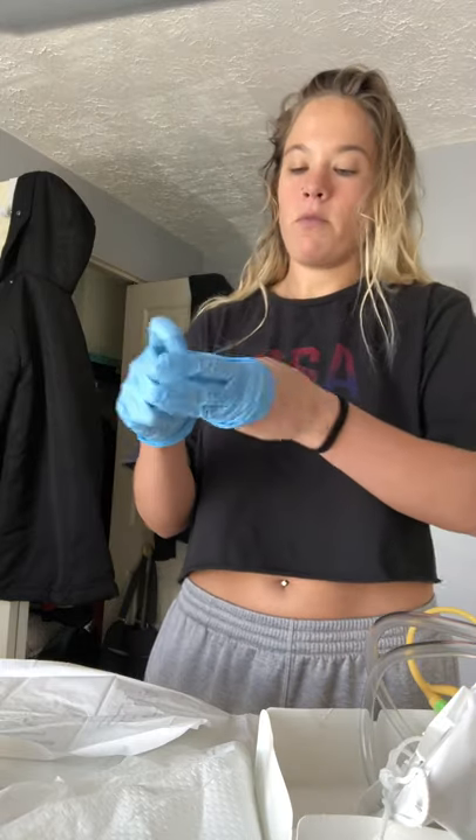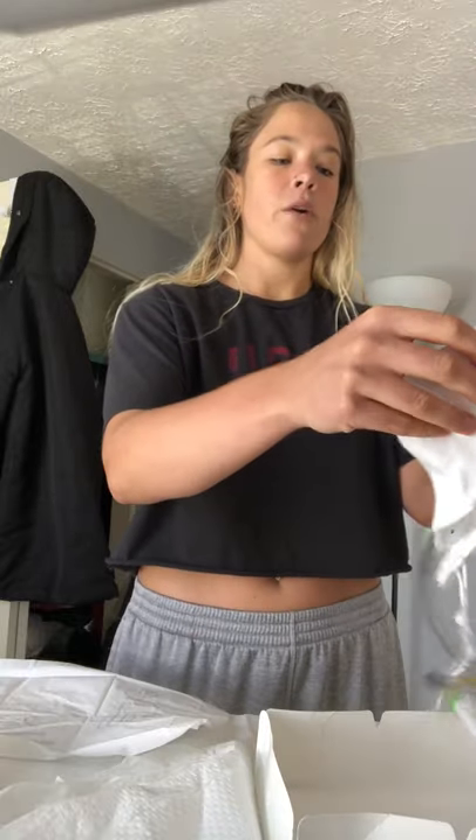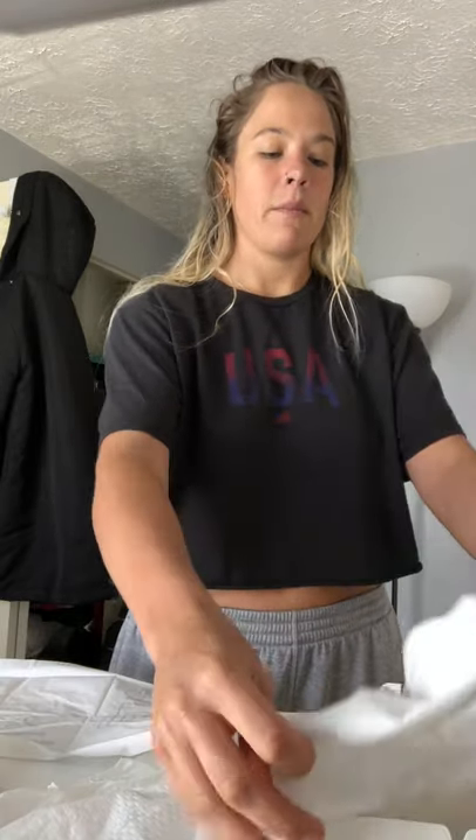I'm going to go ahead and remove my sterile gloves. Then I'm going to go ahead and hang the bag below the bed. Once that's hung, I'm going to get some new gloves and then provide pericare to the patient. And I'm going to go ahead and secure the catheter to her leg with some slack.